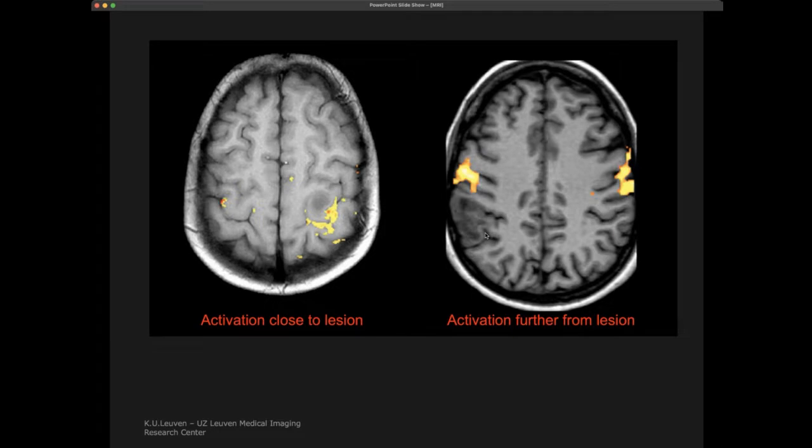And so here again, what we can do is use this for surgery now. Just like I said before, here you see some different lesions. Here you see this little darker gray zone. This is a tumor, and this is another patient with also a tumor there. And for example, when you let them do this kind of motor experiment, you can say, okay, is this close to the motor cortex, or is this close to either the visual or the auditory cortex?